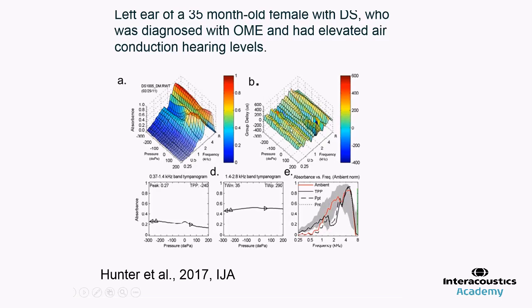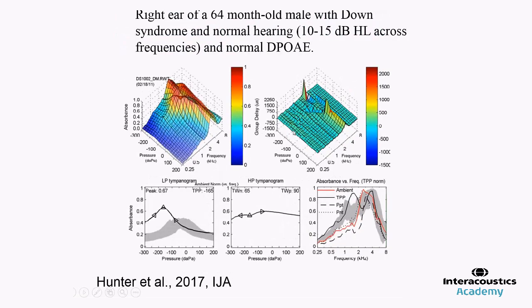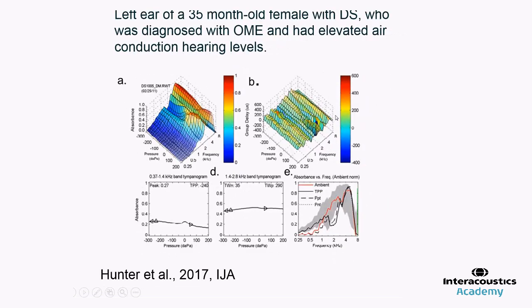And then her phase plot is quite broken up and irregular, and we often see that with an otitis media with effusion case because the phase angles are distorted as the signal is being transferred at different frequency regions. We don't see the nice smooth phase plot with a clear crossover for resonance like we do in a normal ear. It's a bit more broken up.